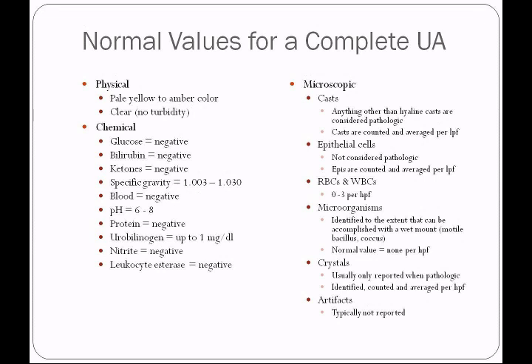Crystals are usually only reported when they are abnormal. They are identified, counted, just like epithelial cells or white blood cells would be, and averaged, reported per high power field. Artifacts such as oil droplets, talc, granules, fiber, and hairs typically are not reported.